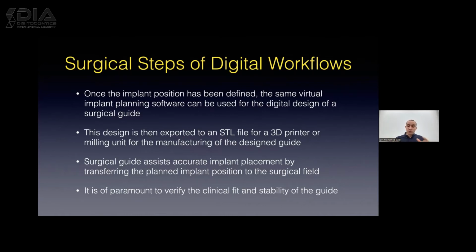Because if the guide is not stable enough, or it does not fit accurately in place, probably you will place the implant in a different position, not the position that you have planned for.